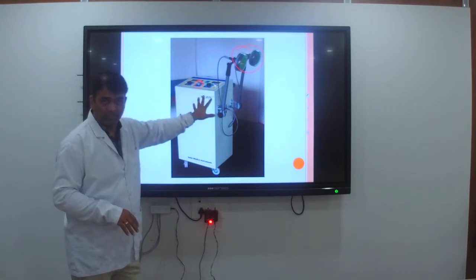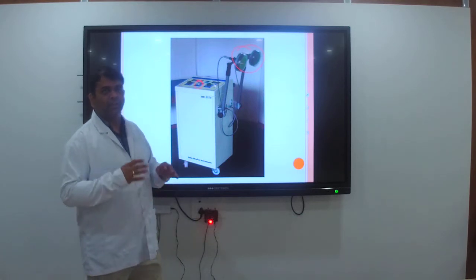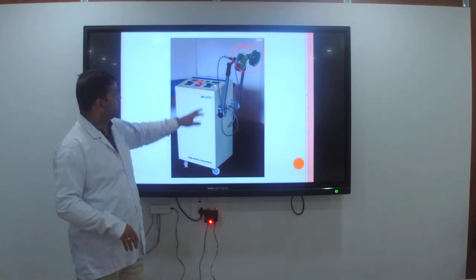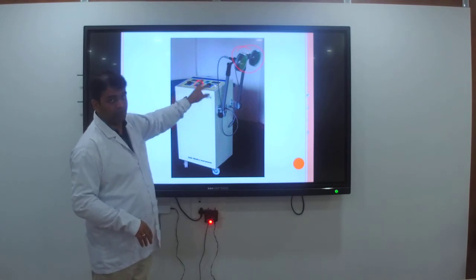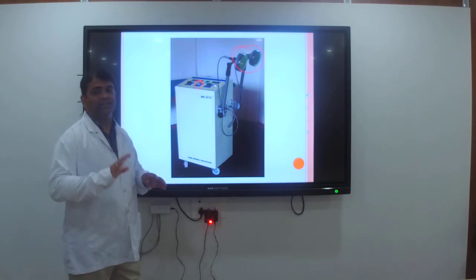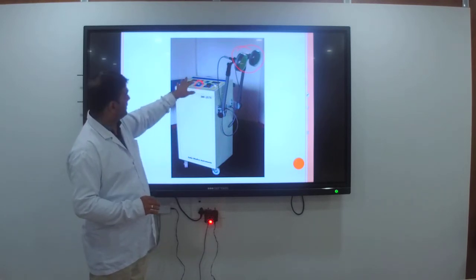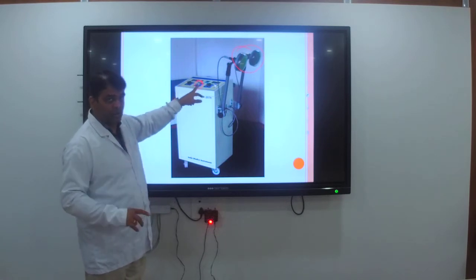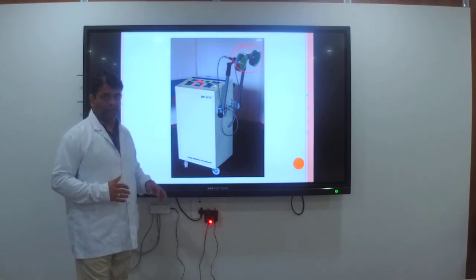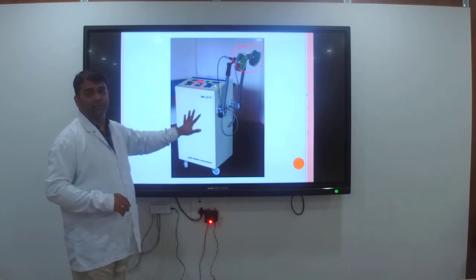When you apply the machine, after 3 to 4 or 5 minutes, it varies from patient to patient, so it depends on the patient's ability. If the patient feels a bit more heat, then the intensity and the power button should be reduced to 2 or 1 as per the patient's convenience. Do not keep it in the same intensity; definitely you will cause a burn to the patient. Reduce it to 2, and again you have to tune with the tuning button to the maximum, what it shows you in the reflection. Okay, fine, you got it. This is the way you use the SWD machine.